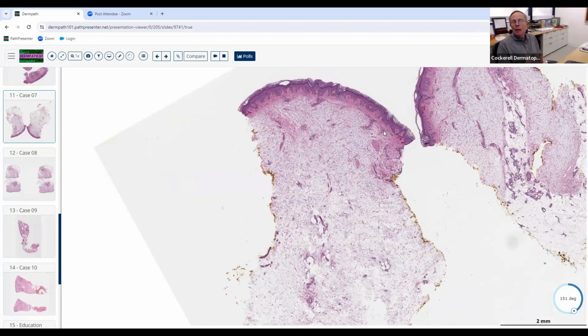So it's a little bit different. We talk about inflammatory and neoplastic, and this is a slightly different ball game. It's a deposition disorder. Something has come in that doesn't normally belong here, and it's deposited. Now, that may not really be the way this happened this time. It could be a low-grade inflammatory process that produced all of this material. That's another possibility.